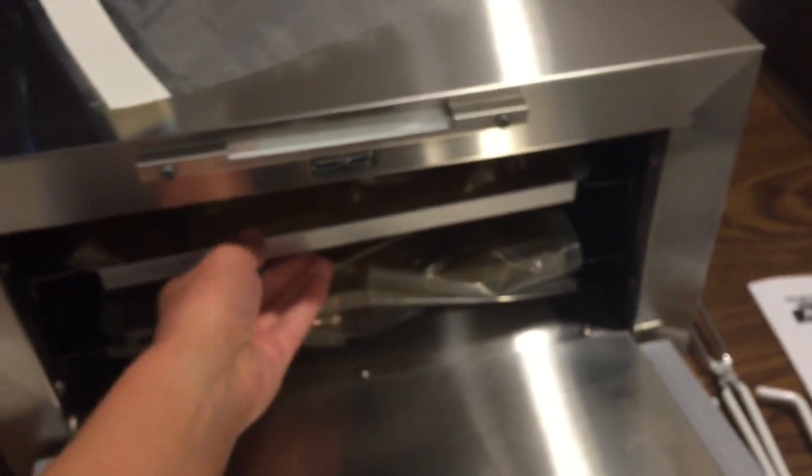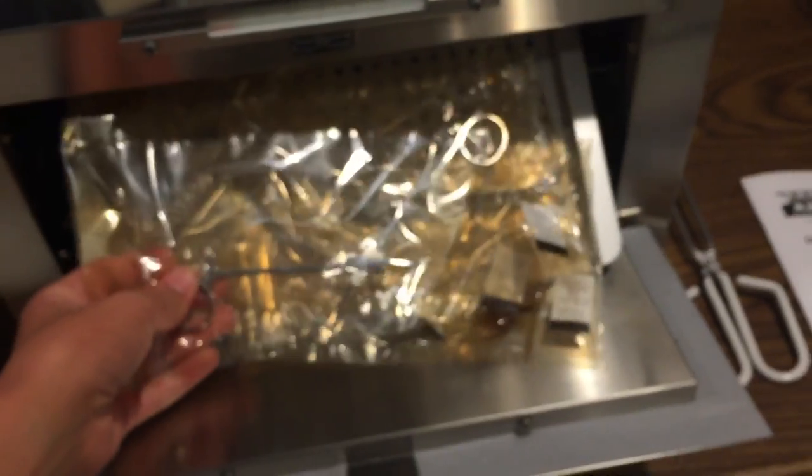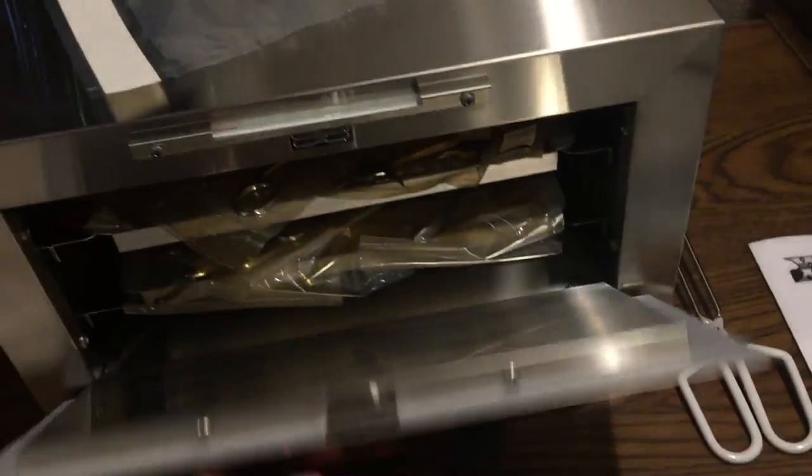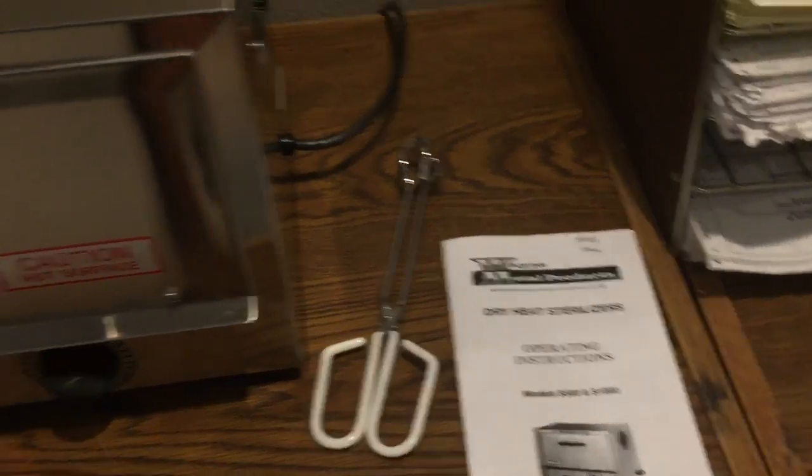It opens right here — pull this out. Here is the scissors, packages, whatever we need to dry heat sterilize. This is how the pouches look like, and that's what we pull it out with.